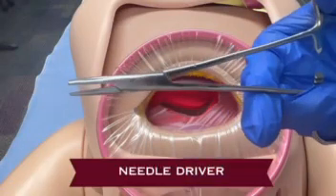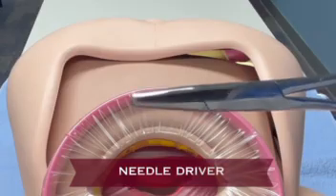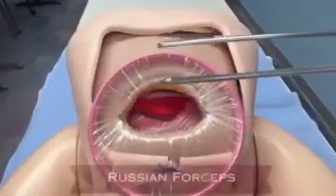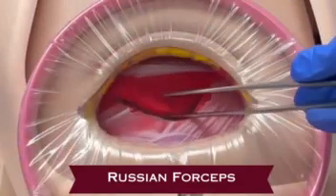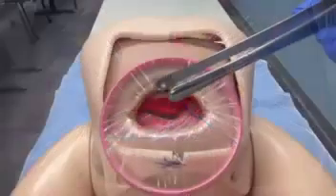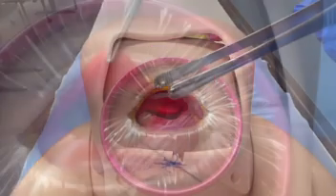Needle drivers are the primary instruments for suturing. Needle drivers are distinguished from other clamps by shorter jaws, longer handles, and bidirectional teeth, allowing grip of the needle in various positions. Russian forceps are used for retraction and suturing during uterine closure. Their rough, circular tips provide secure, atraumatic grip over large tissue surfaces.